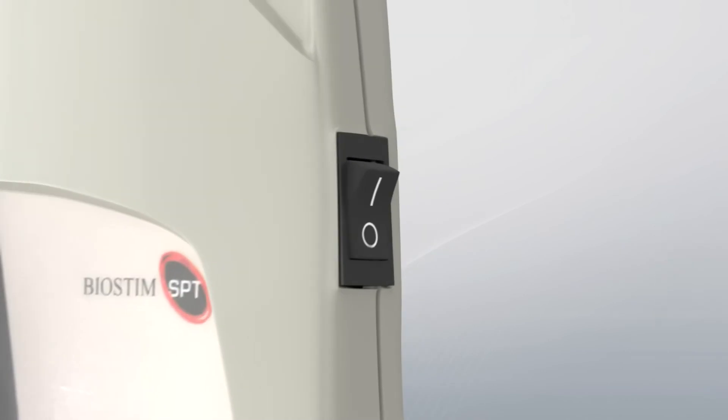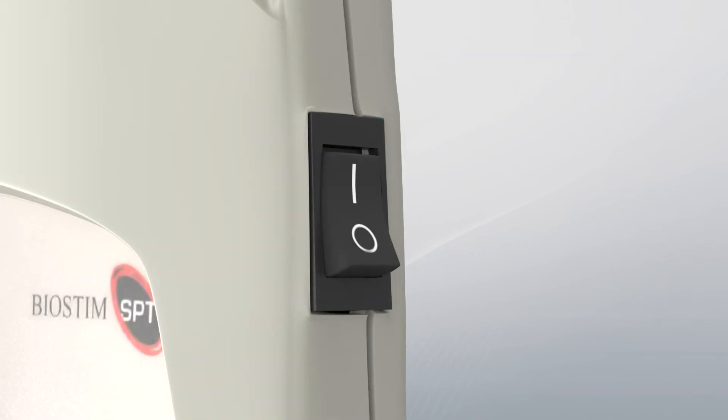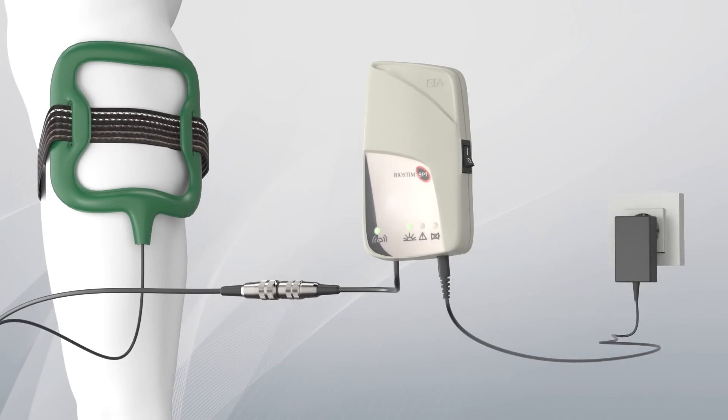Now turn on Biostim SPT to start the therapy. The treatment parameters are preset according to your condition. The device uses undetectable frequencies, so don't worry if you don't feel any sensation.